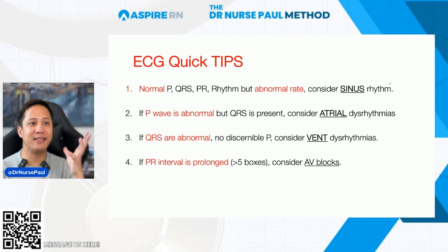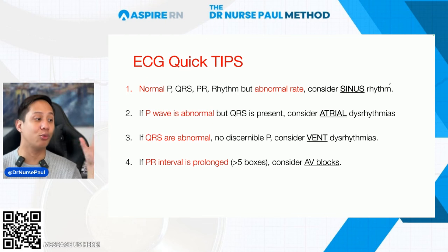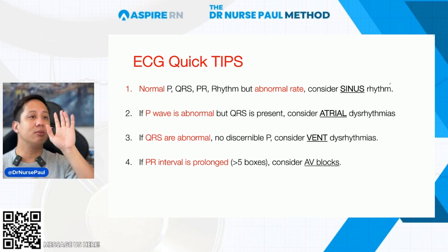But if there's anything else that's abnormal, then that's not sinus. Sinus is only a rate problem, because remember, sinus controls the rate and the rhythm. So if only the rate is the abnormality, then that's sinus.